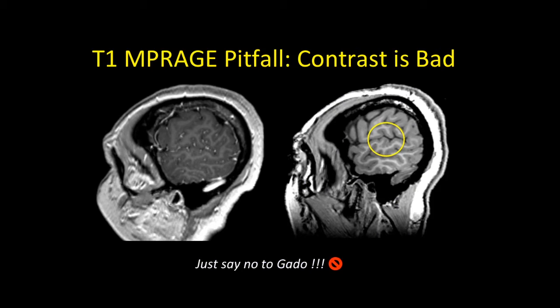So just say no to gadolinium. Just get a regular spin echo 2D T1 post contrast if you're going to do that in your protocol.